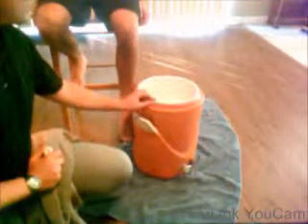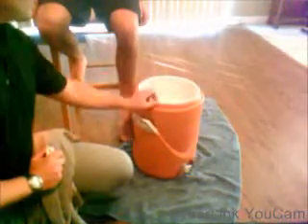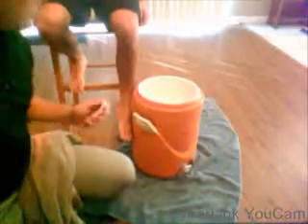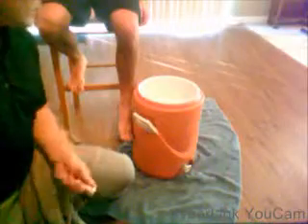You want to make sure the temperature of the tub is between 32 degrees and 79 degrees Fahrenheit, or to patient comfort. I have assessed the temperature of the water itself, and it is 33 degrees Fahrenheit, so cold.